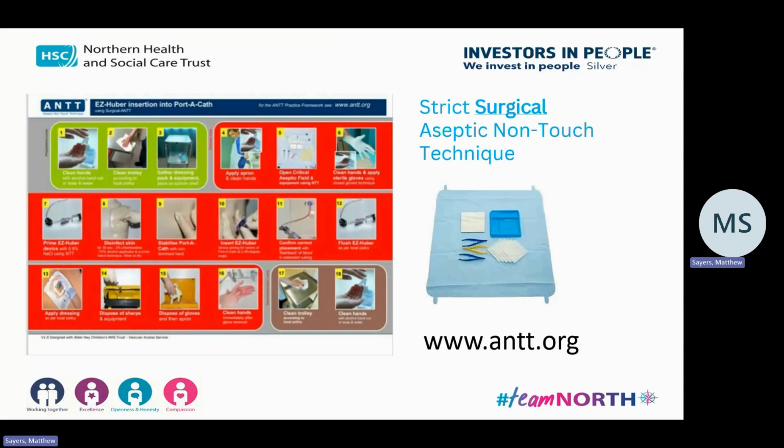There is one particularly for insertion into Portacaths. So it's strict. If you haven't done it for a while, or you're just not sure that you're doing it right, just revisit that, because it is really important when you're accessing a port.